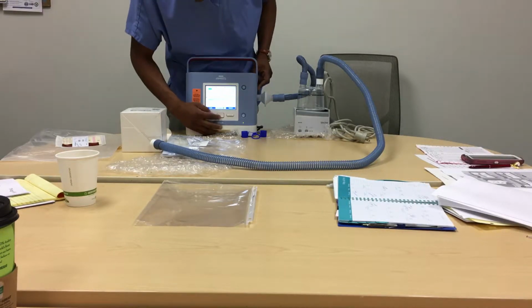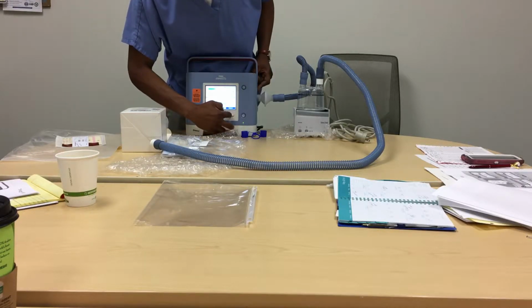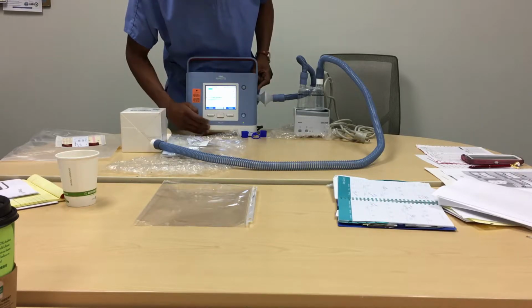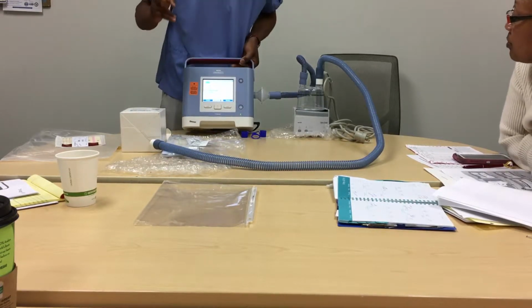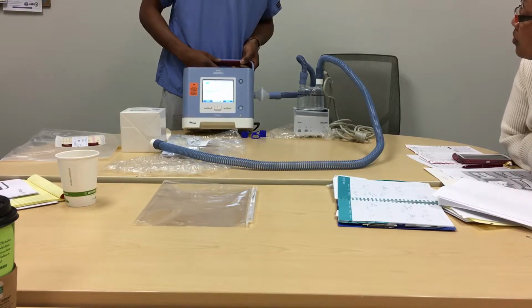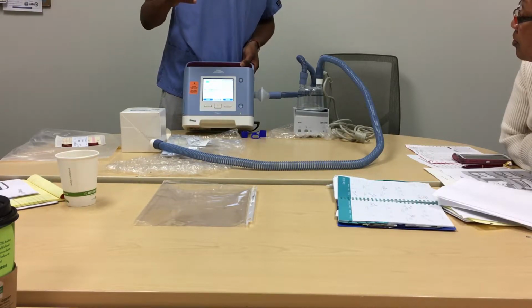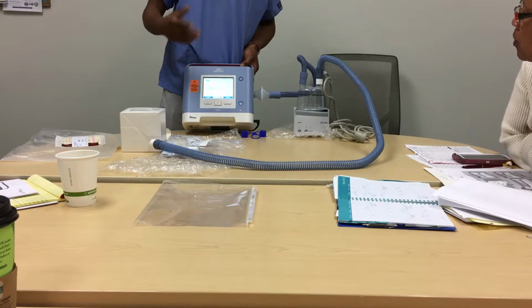And now let's scroll through the settings and the alarms. You scroll down, highlight your settings and alarms, click into it. The first thing you see is, if you have a dual prescription, patients, typically neuromuscular, typically have the daytime and nighttime settings, right? You could choose that option. But what we do all the time is typically ST mode.